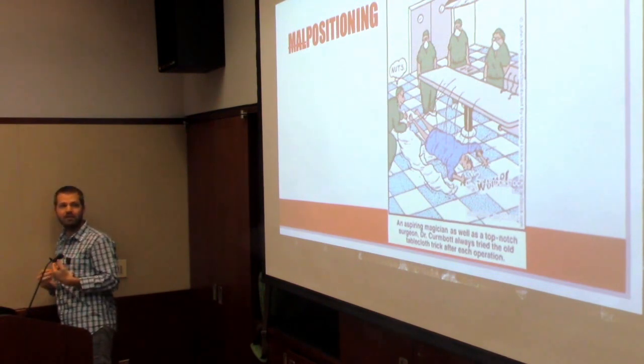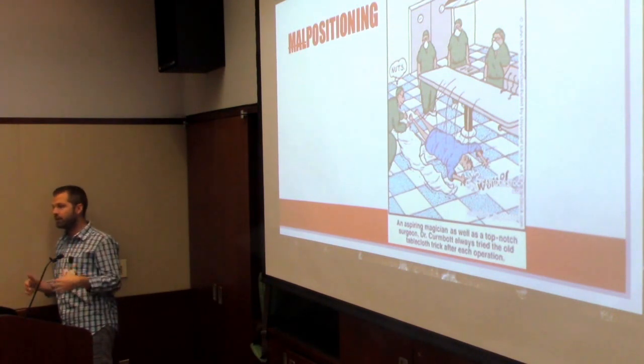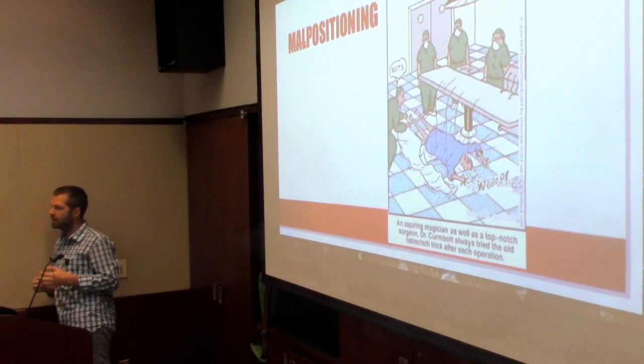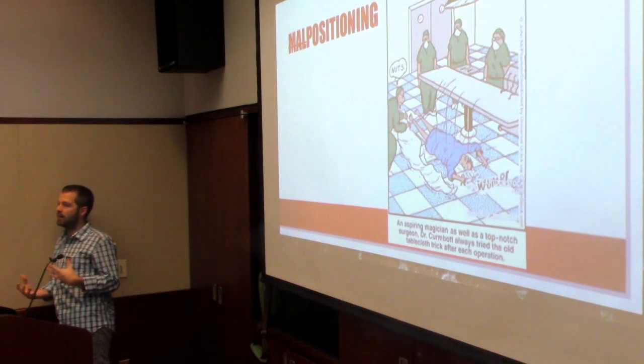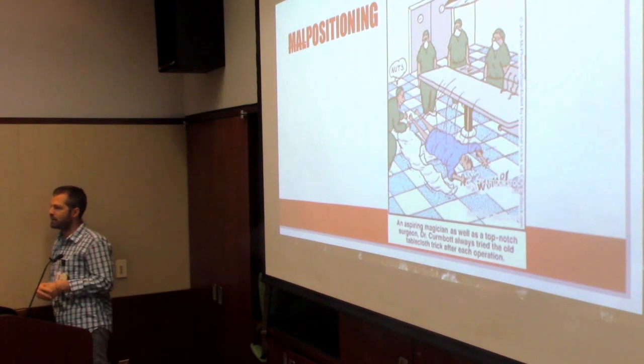One of the best places to practice this, I found, was in the MICU, where people had central lines that needed to come out, and I would spend forever looking up and down their arms, finding the best possible target and putting everything in different positions to see how I was comfortable, and find your own groove for how you want to position people. Most times I see people fail on procedures, things are spread out, they're trapped in a corner, they just look uncomfortable, and I think that's a huge contribution to why we screw up, because the physical task of sticking a needle in a vein is actually relatively easy, but if you're uncomfortable, it just increases the odds that you're going to fail at some point.